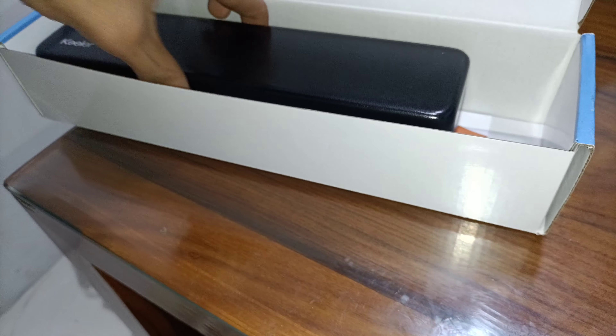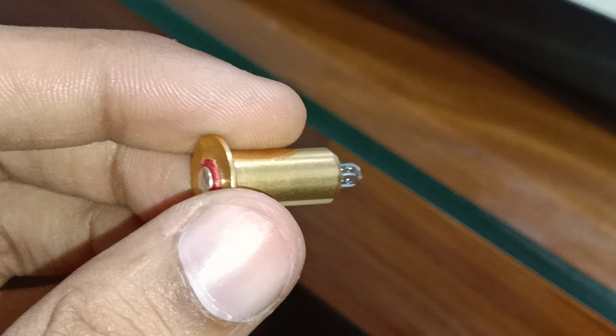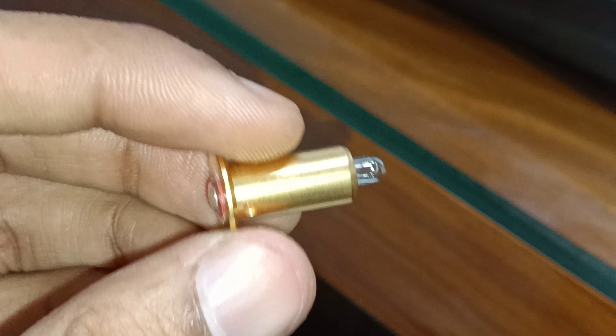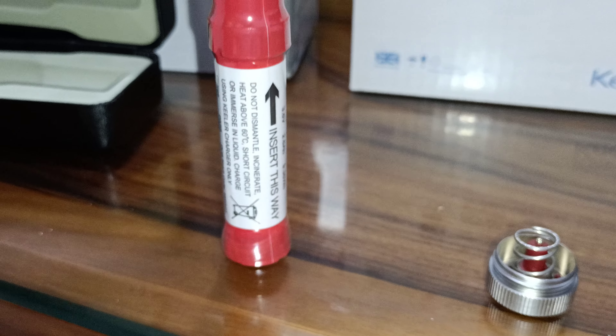This is the charger handle. It also includes an extra bulb, and it comes with a lithium battery that is rechargeable.